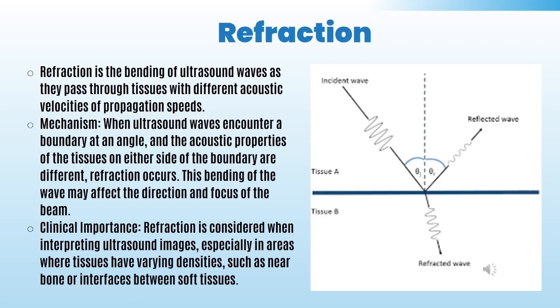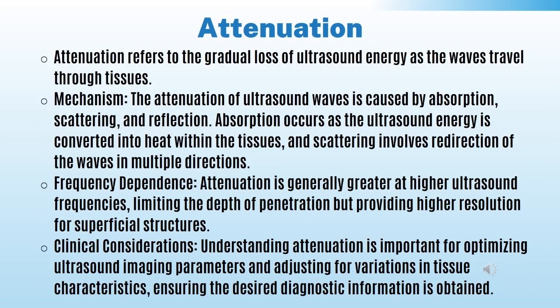So if you look on this slide, there's an image here that explains what the beam is doing in the image. It's being bent by the signal. And now we get to attenuation. Attenuation refers to the gradual loss of ultrasound energy as the waves travel through tissues.